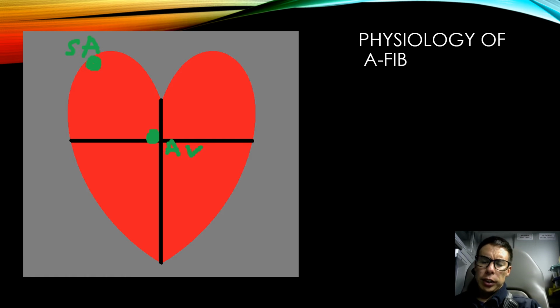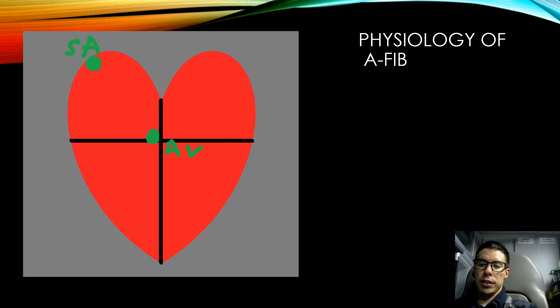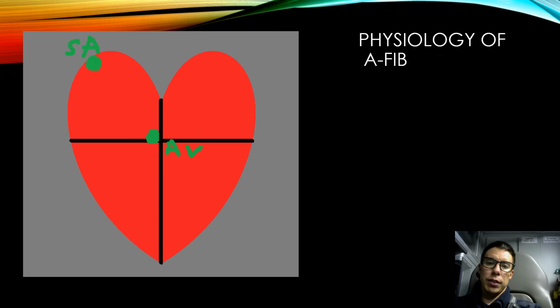In this video, we're not as concerned. It's just, I figured that it's a good thing to understand, and it's an interesting thing that happens. So that's why I talked about it. But this course is mainly just to be able to interpret the rhythms. It's not as much into that pathophys side of understanding, or in depth at least, what's going on. But that one I felt was worth mentioning. But to summarize atrial fibrillation, it's just different pacemaker sites trying to fire at once, which result in the atria quivering.